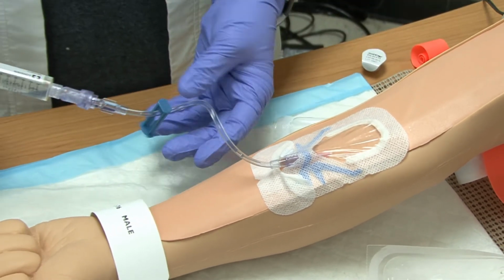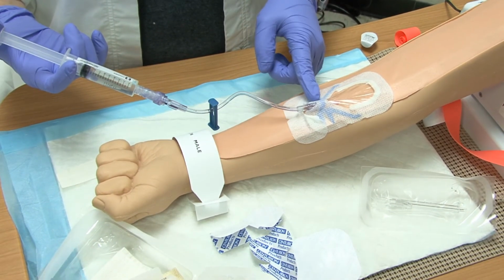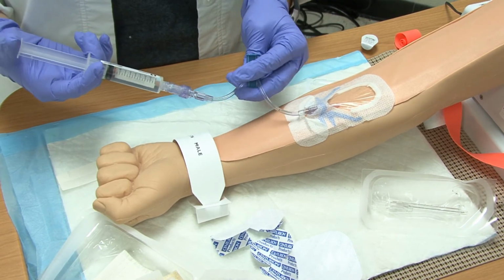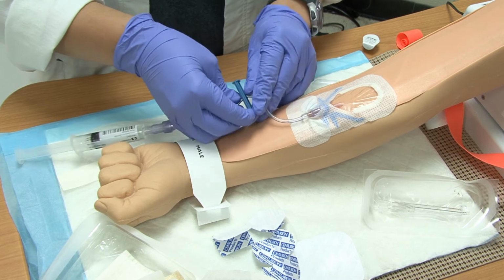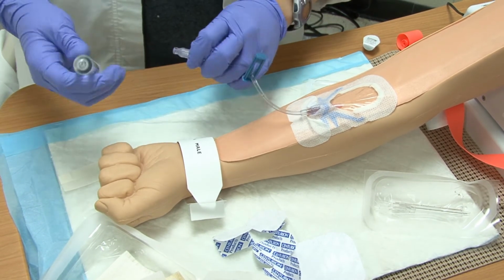You want to always keep your saline lock clamped because you could potentially have blood return down through here. So what you want to make sure and do is, as I'm flushing, and it's kind of hard, you've got to have like three hands, as I'm flushing, I want to go ahead and clamp the clamp. And what that does is it keeps the blood from returning down. Now I can actually go and take the saline flush off.